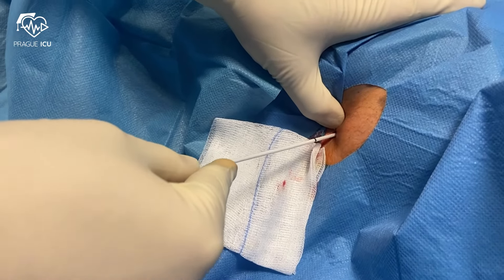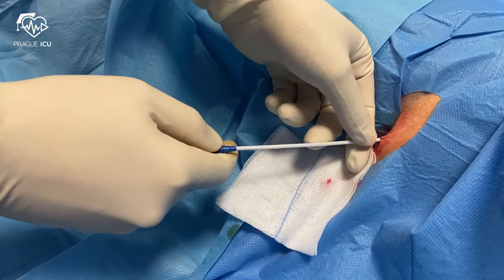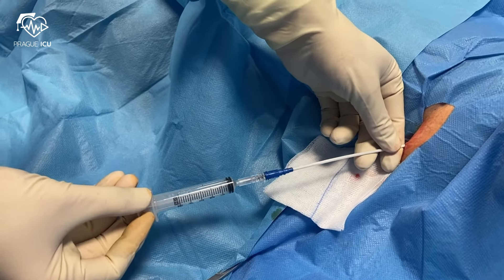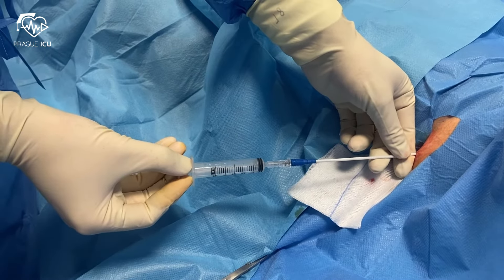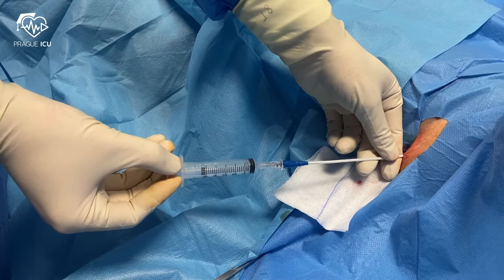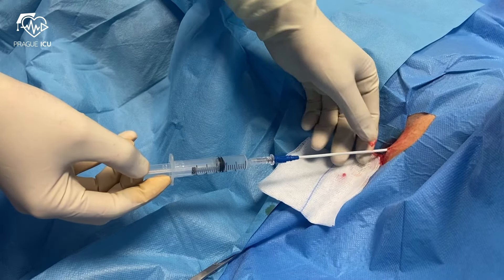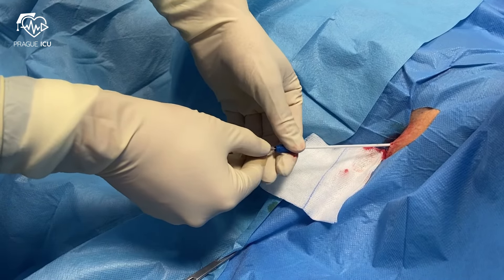Then proceed with the pleural catheter insertion. We always aim to place the catheter closer to the superior border of the rib, as this should avoid injury to the intercostal neurovascular bundle. If the tube is meant to evacuate a pneumothorax, aim it apically towards the top of the lung. The syringe attached to the end of the pleural catheter will inform you once you enter the pleural space. Now you can appreciate aspirating air from the pleural cavity. Then you stop pushing.